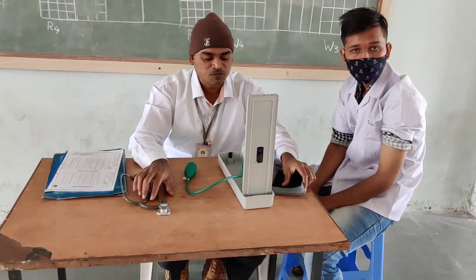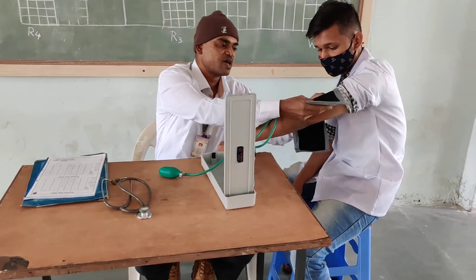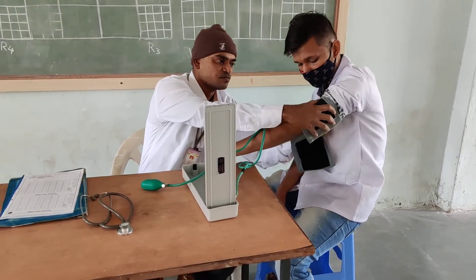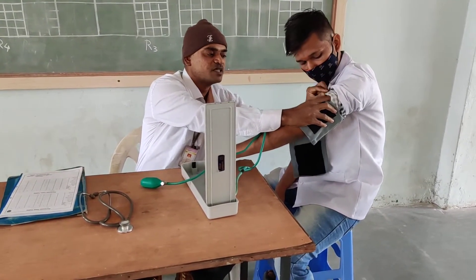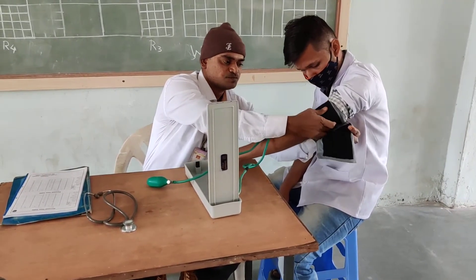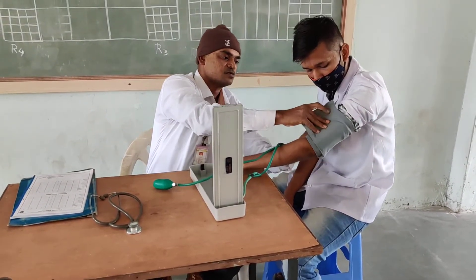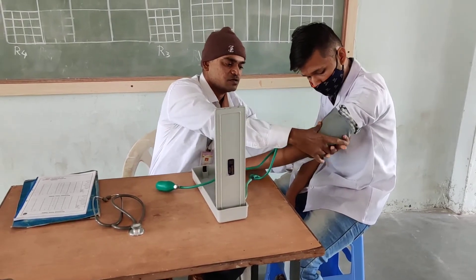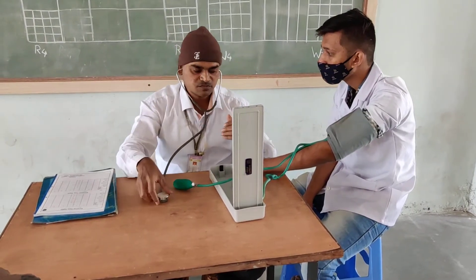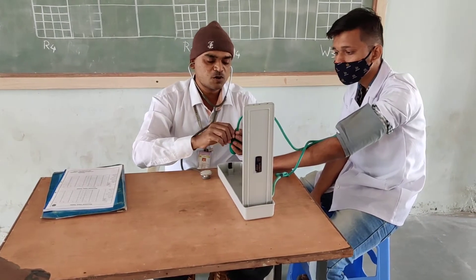Now, in this practical, how we perform: we have to wrap this airbag on the hand of the subject. We should ensure that we are wrapping this firmly to the hand of the subject. After wrapping, I have to close this knob.